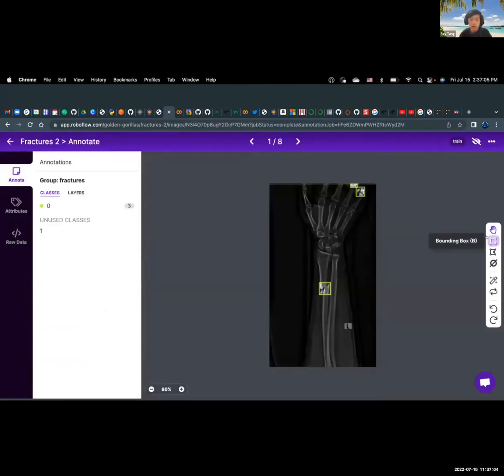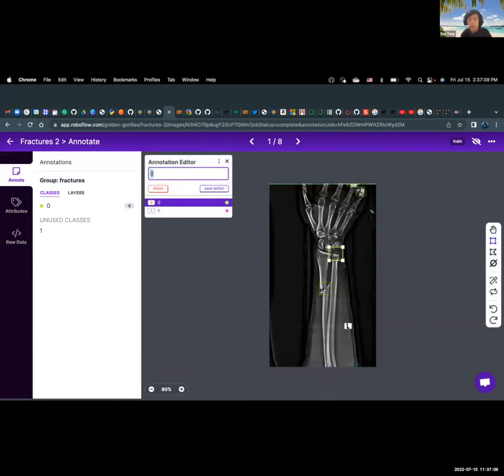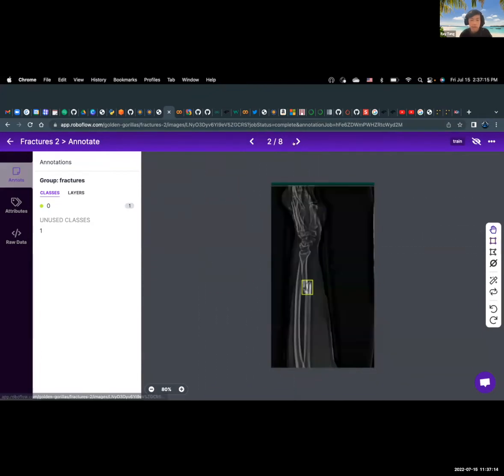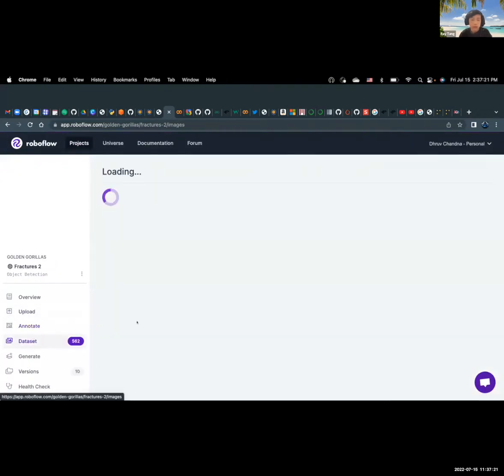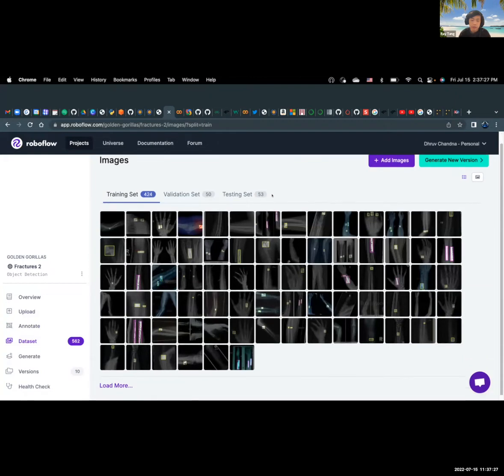At first we only had 400 images, so we split an equal portion of images to every single person. As you can see, we are able to draw bounding boxes on the images so that the AI model can use these images to train on. But 400 images isn't a lot to train an AI model on. Because of that, we decided we would augment the data.